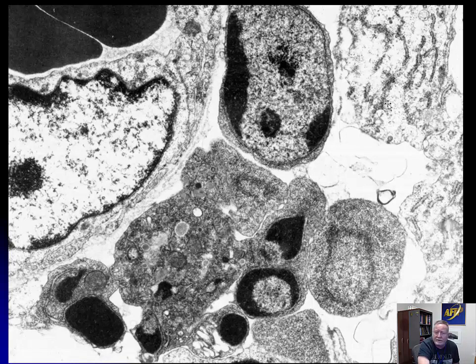We're looking at a case of leukemia in a mouse, and whenever you have tremendous proliferation of lymphocytes, you pretty much always have tremendous death or apoptosis of lymphocytes as well. In any really hot neoplasm, there's a lot of turnover, and a lot of that's due to apoptosis.